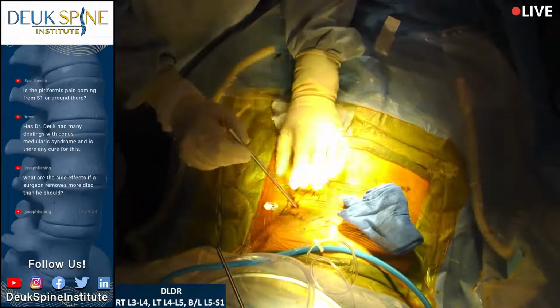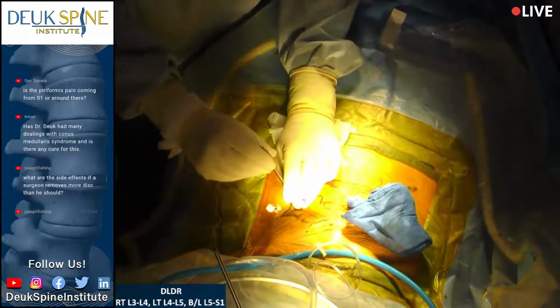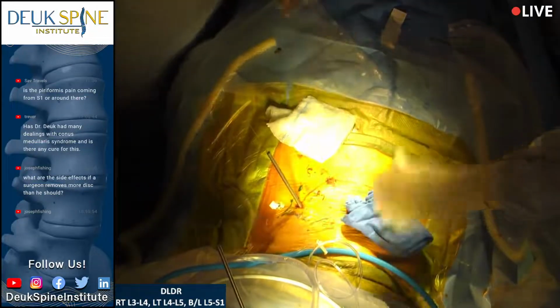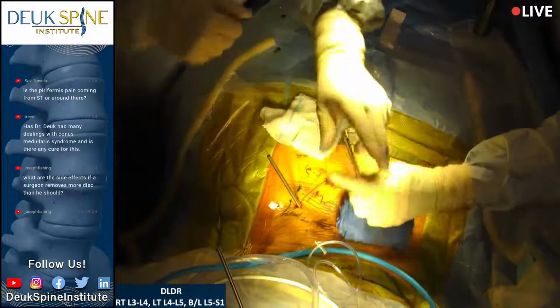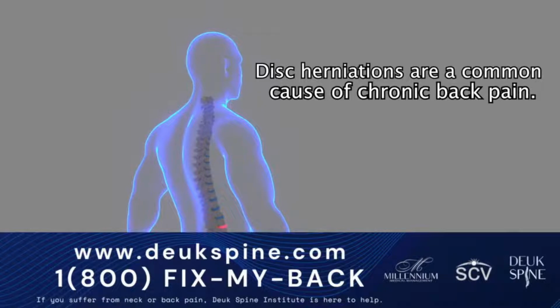Any more questions from our audience? No, sir, not at the moment. So let's run the Deuk laser disc repair animation again for them so they can see what it is I'm about to do here at L3-4. Disc herniations are a common cause of chronic back pain.